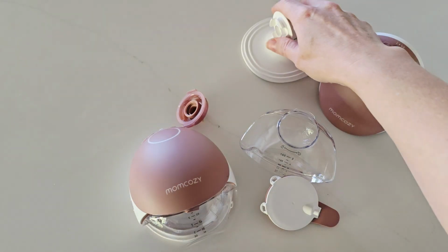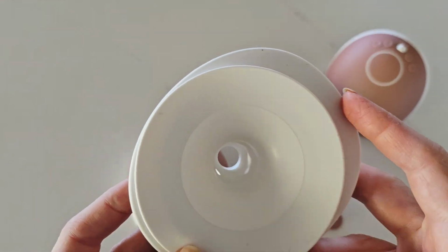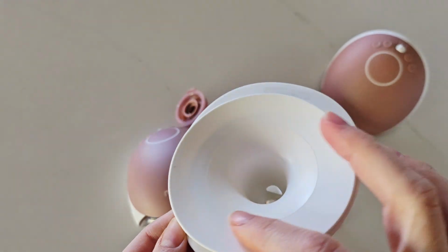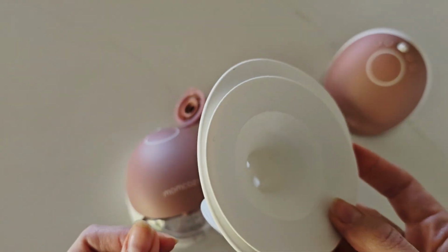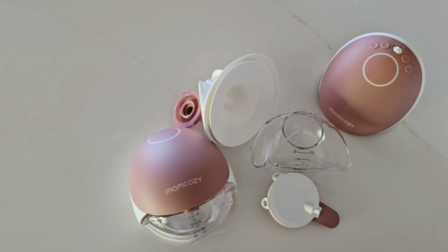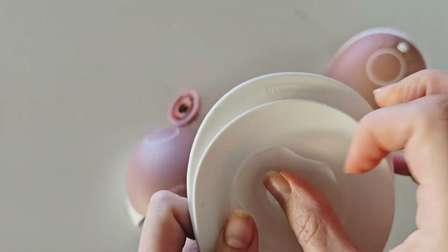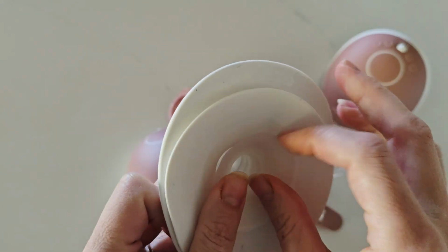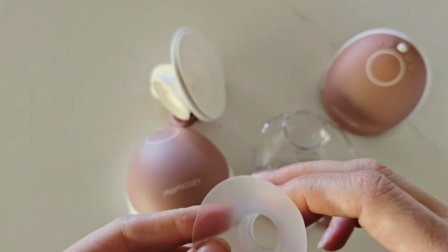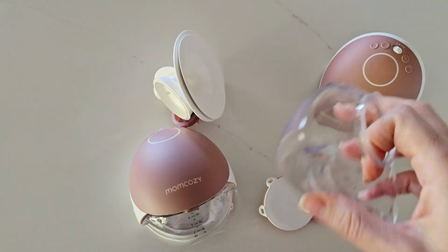Then you have your flange. Now your flange generally only needs to be replaced every 6 months or so. You may get longer, you may get a little bit less. If you get any scratches or any stretching on this, that is when you look to replace it. Your flange inserts, and sorry, I should have got one out prepped. Your flange inserts, however, they sit inside, so these are going to get a bit more stretch and pull, especially when you're pulling them out regularly to clean these. So you may only get 3 to 6 months usage out of your flange inserts before they need to be replaced.